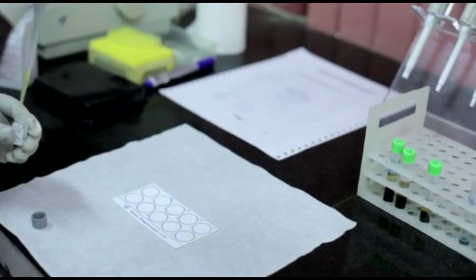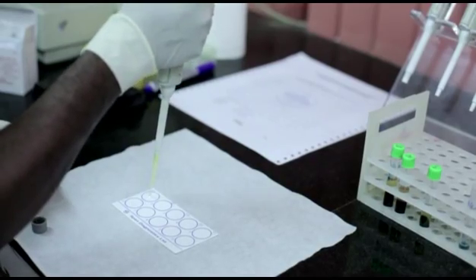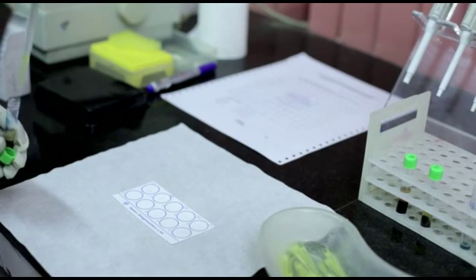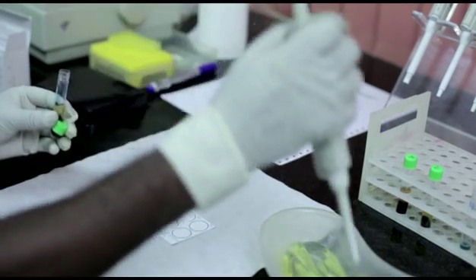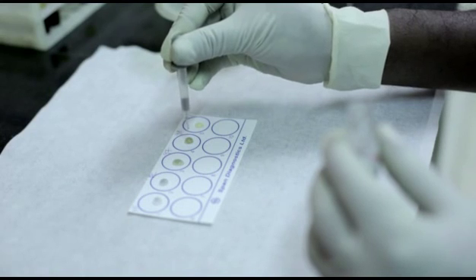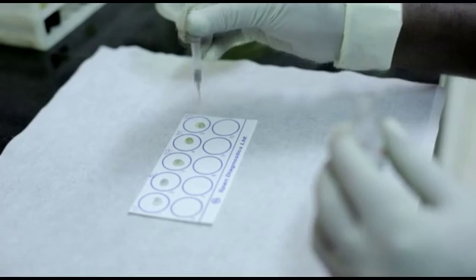The procedure is as follows. First, bring the kit and reagents to room temperature. Mix the carbon-coated antigen suspension by gently agitating before testing. Place 50 microliters of patient's serum, positive and negative control, in the circles using sample dispensing pipette. Add 1 drop of carbon-coated antigen to the serum sample using antigen delivery dropper.